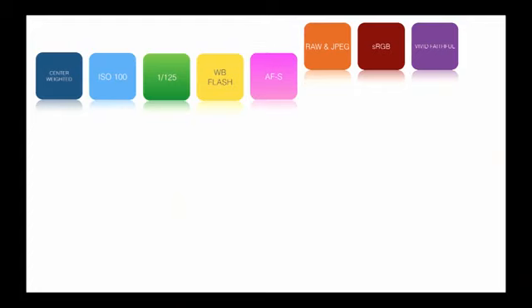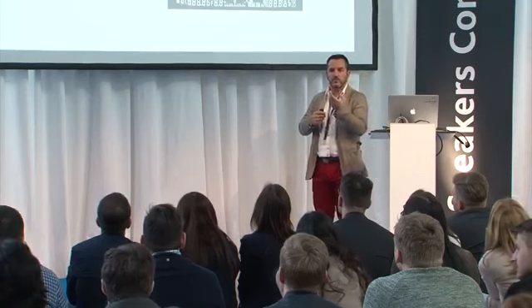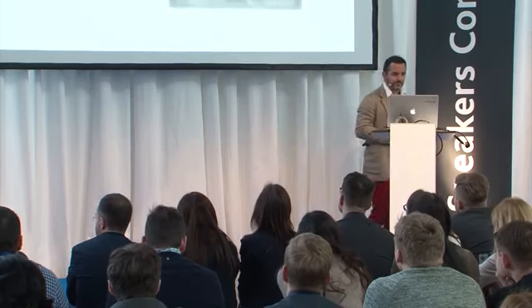Then we have autofocus single. I'm always using autofocus in my office because I always have good light. Every laboratory or every dental studio should have good light inside. So then you can use autofocus of the lens because it will be much, much faster. If you are trying to do your manual zoom and manual focus, you will lose time. And my protocol is everything about time saving, not about losing time.